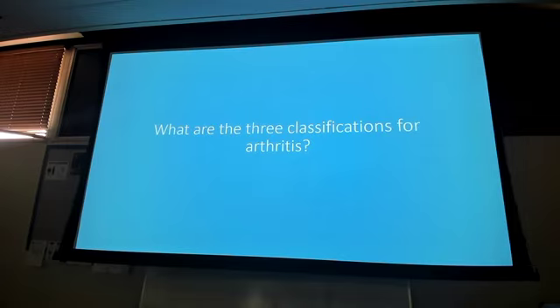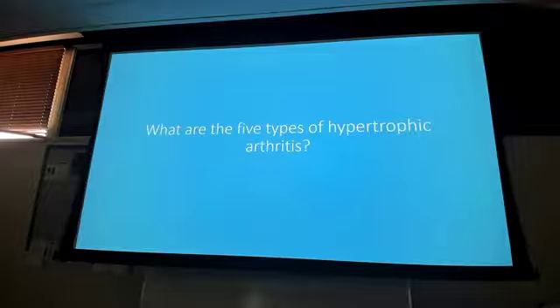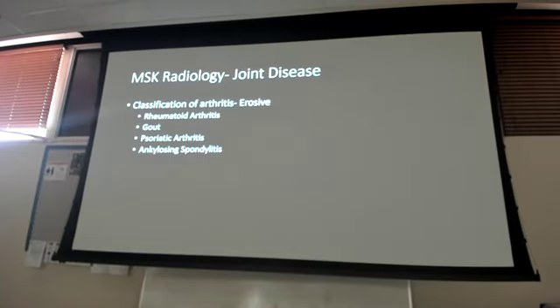So we just covered hypertrophic, or we didn't cover all of those yet, but hypertrophic, erosive, and infectious kinds. We went over the hypertrophic ones. Questions on the hypertrophic arthritis is how to distinguish one from another. A lot of the x-rays are kind of similar, except for that Charcot's, right? So then it becomes, is there that one thing like the golden uniformity? What is the patient population? What's going on? Use everything I'm giving you to try to paint that picture of what that patient should look like in your head. Let's go into the erosive ones.